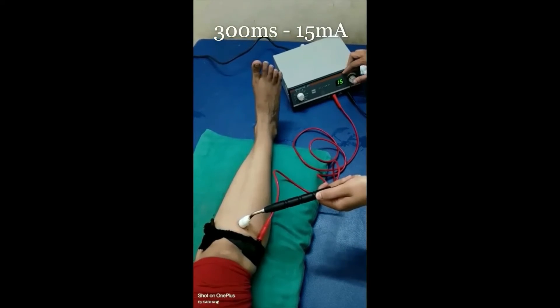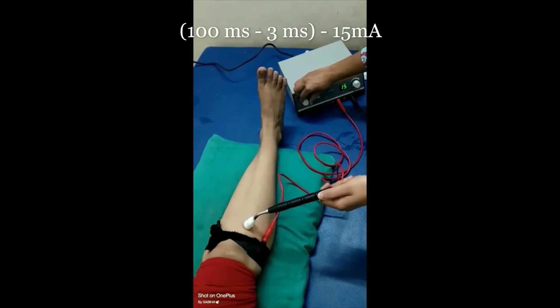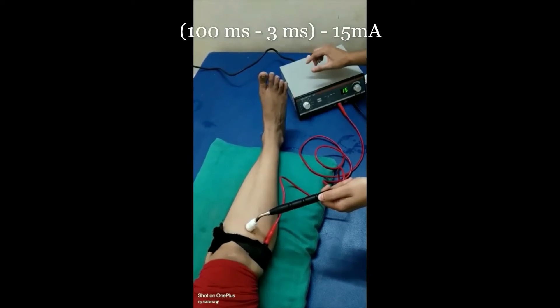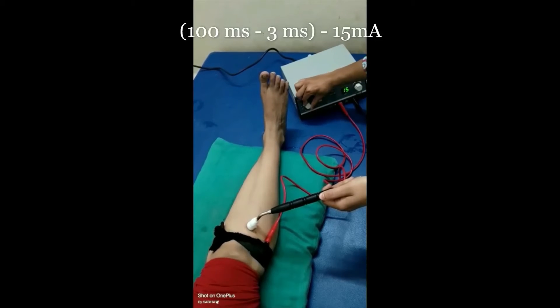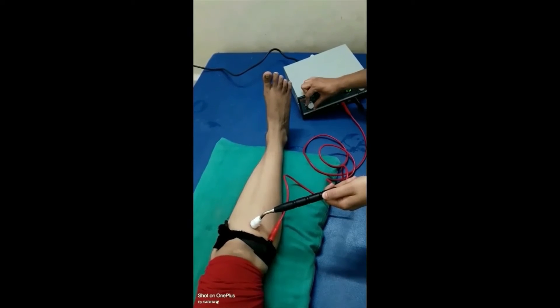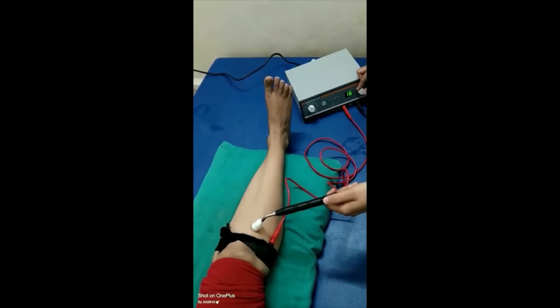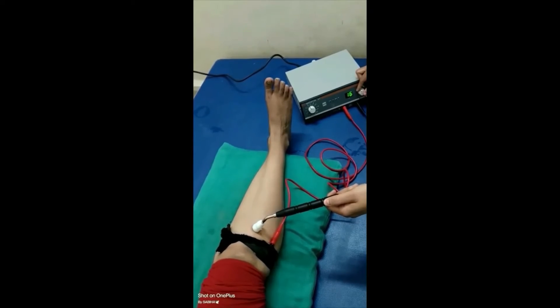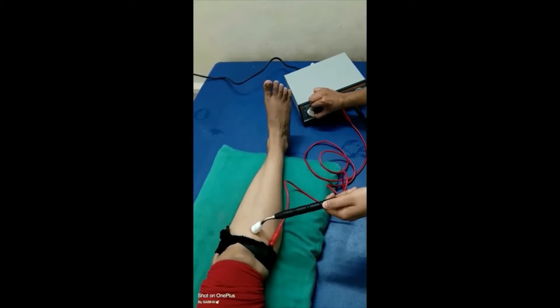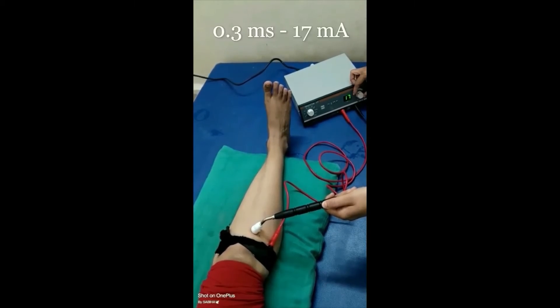Reduce pulse duration to 100 ms, then to 30 ms, then to 10 ms. Next, reduce pulse duration to 1 ms and increase the intensity until minimal muscle contraction is visible.